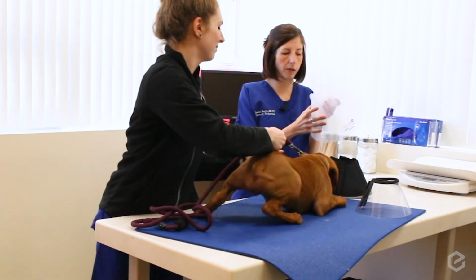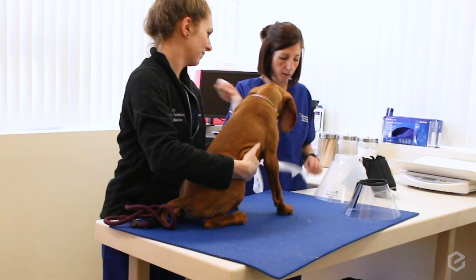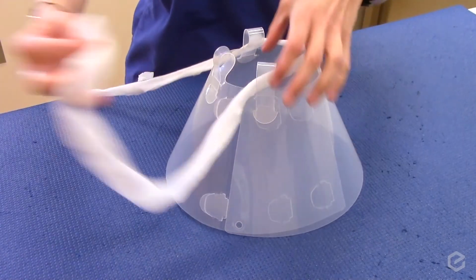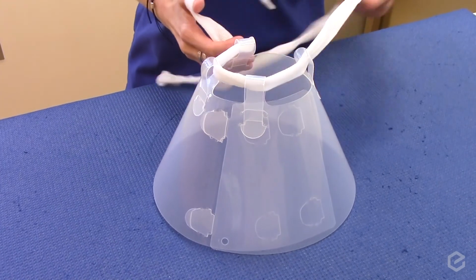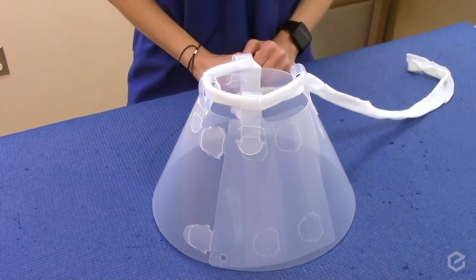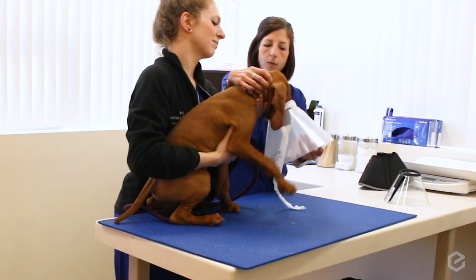You can either put their collar through the top here, or you can take some rolled gauze and make your own collar to be able to tighten it to the level that it needs to be. So it just goes through here. And you want to make sure you don't have too much extra string on there as it could get caught on something. So now this just slips right through their head.